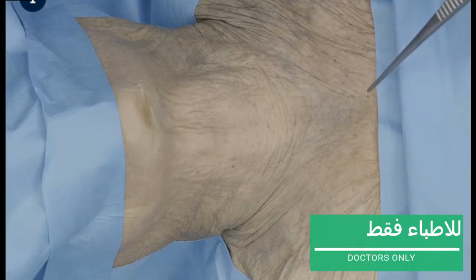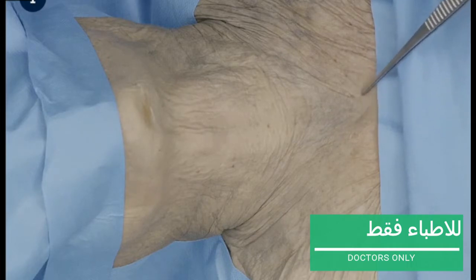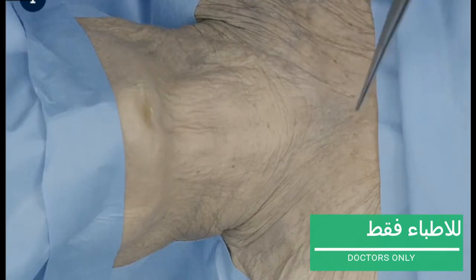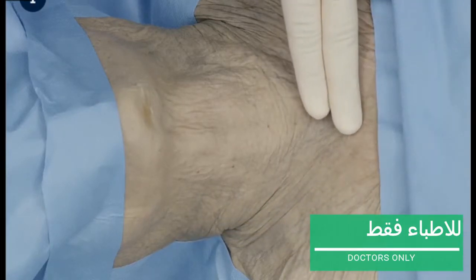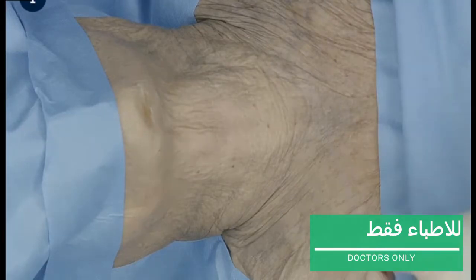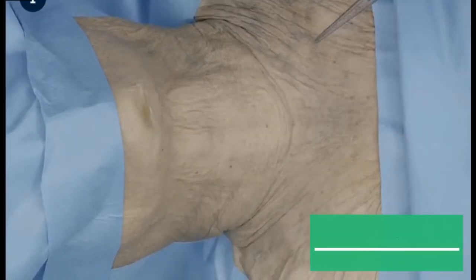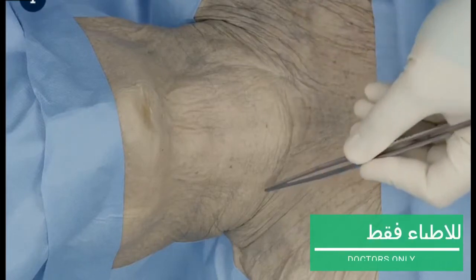The following landmarks are used to determine the location of the skin incision: the sternal notch and the chin. The sternocleidomastoid muscle marks the lateral border. The incision is placed two finger-breadths above the sternal notch in a skin fold. To create a symmetrical incision, the skin can be marked by pressing a thread onto the skin. The incision is bordered by the medial margins of the sternocleidomastoid muscle.